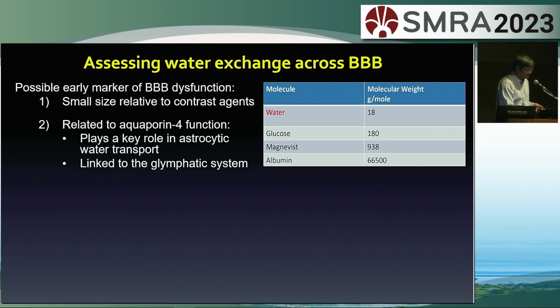I'm spending the rest of the time talking about using water. There is growing interest. Why? First, you don't need a contrast agent.